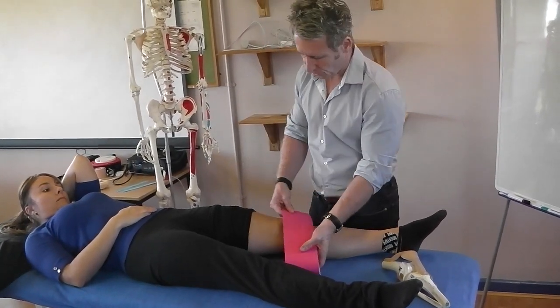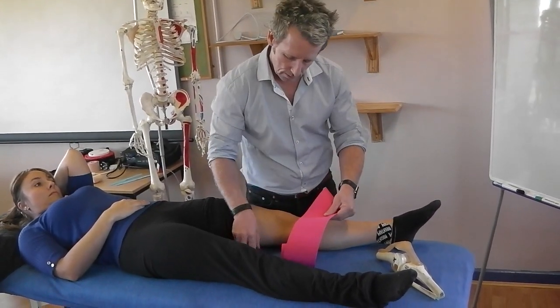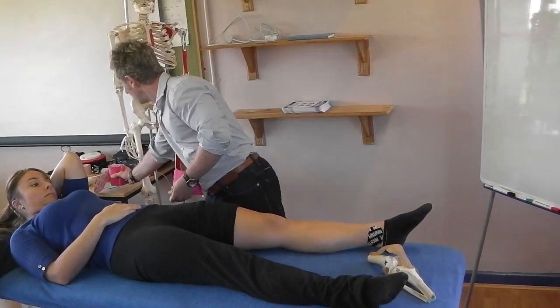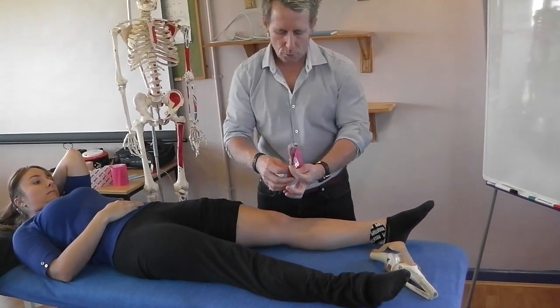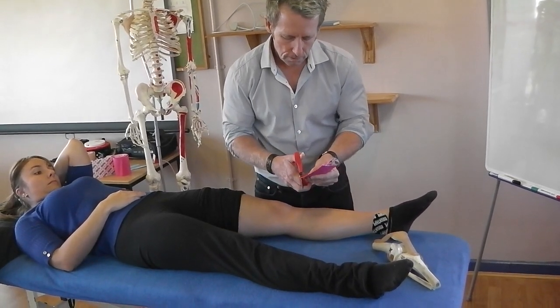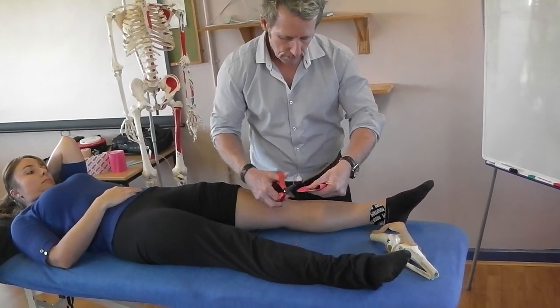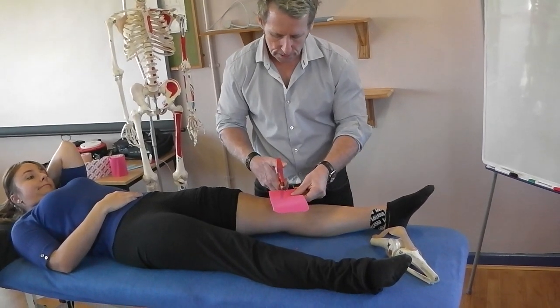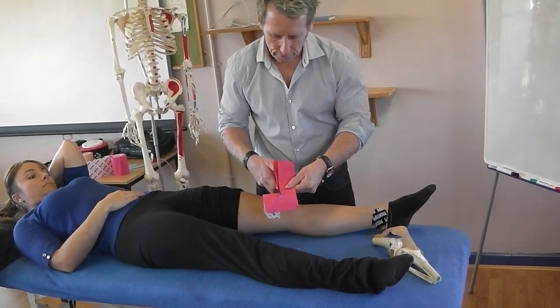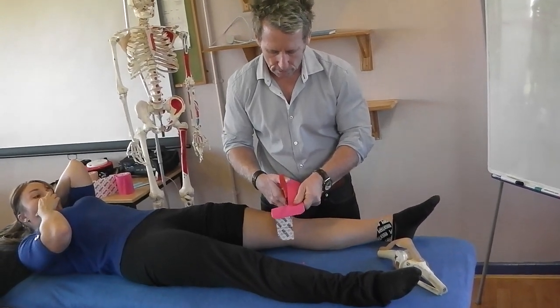First of all, take the measurement from the lateral side — from the lateral LCL to the MCL area — give or take a few millimeters, and cut that tape. That will be the rough size. Then I'm going to round the ends, getting rid of those corners on both sides. Then I'm going to cut the tape down the center. We would cut to roughly the first square if they have squares on the back.